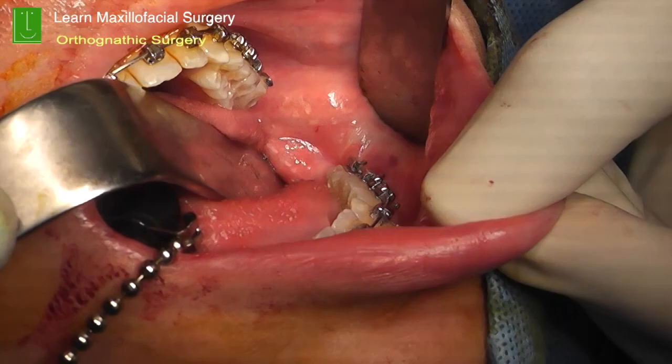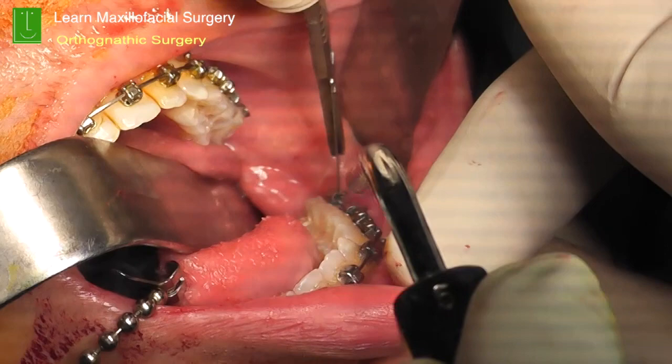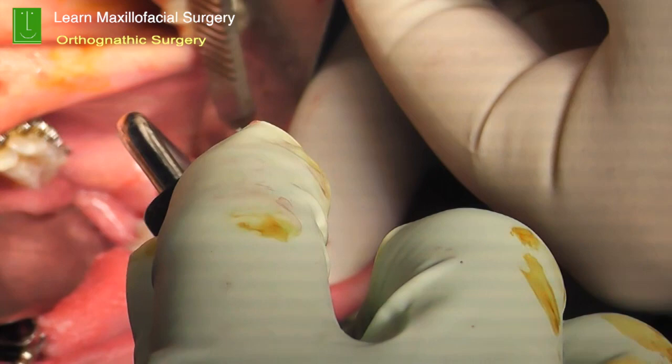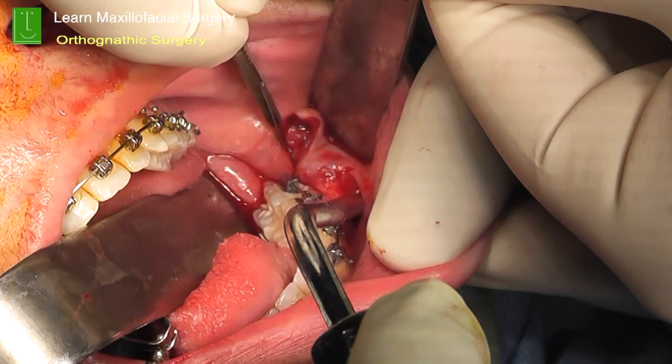Again, as I said earlier, giving local anesthesia helps in reducing the amount of bleeding when you make your incision, and that's where you're seeing the distal cut. So feel the anterior border of the ramus of the mandible and take your distal cut right onto the anterior border of the ramus of the mandible. And then you make your mesial cut. That's the forward cut which you are doing. Try to get a triangular point so that it is easier for you to approximate the tissues. And again, make a definitive cut to the bone.